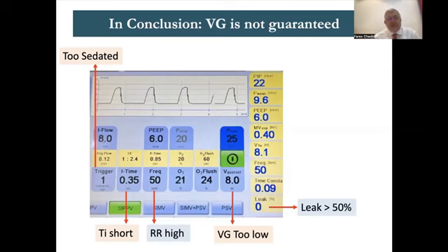As you see, every single setting that you change has an effect on the volume guarantee. It's much less guaranteed than you think, and it's much more complex than anyone would love to believe.